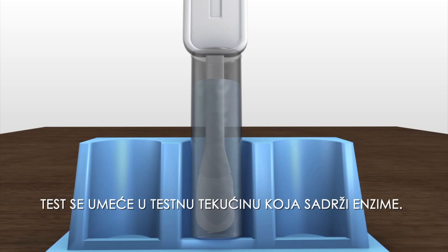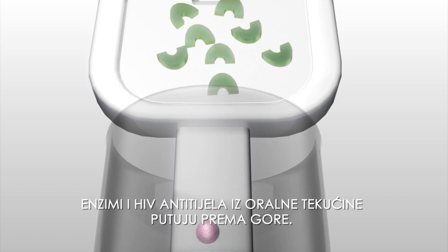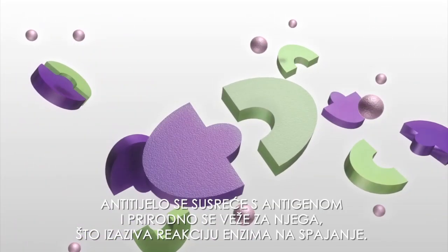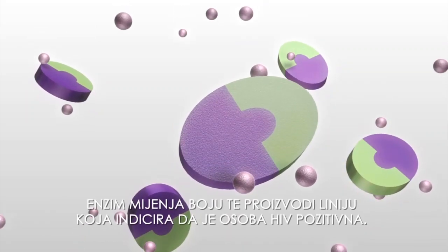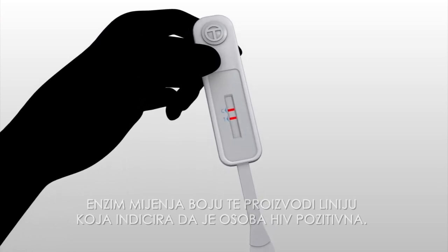Both the enzyme and HIV antibody from the oral fluid travel upward. The antibody meets the antigen and naturally binds to it, triggering the enzyme to react to the binding. The enzyme changes the colour of the test paper to produce a line to indicate that the person is HIV positive.